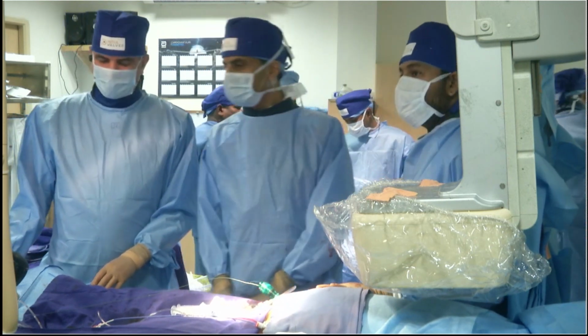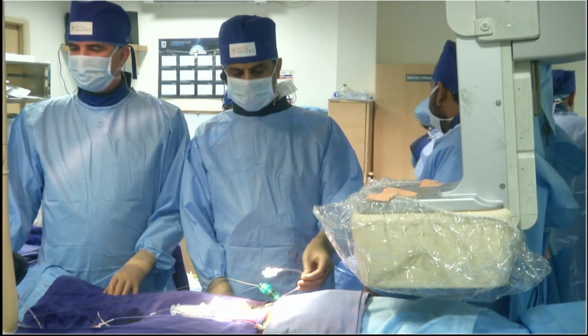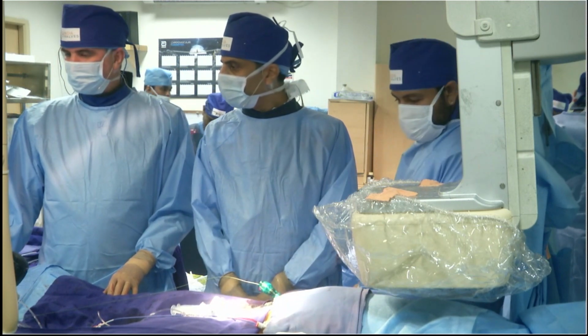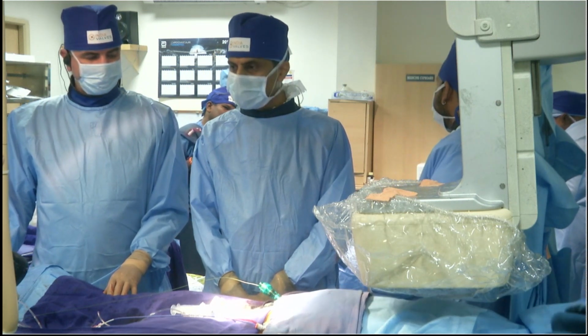Usually the first time we move 10 degrees each, and if there is a huge difference, we use 15 degrees. In case of very fine tuning, you can just move 5 degrees.